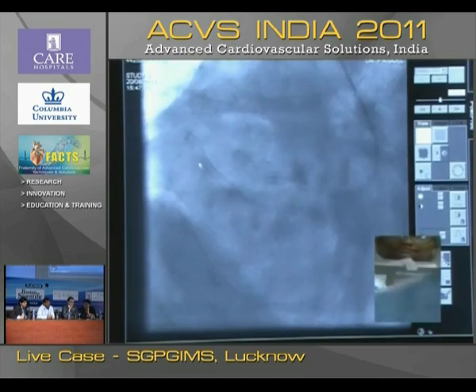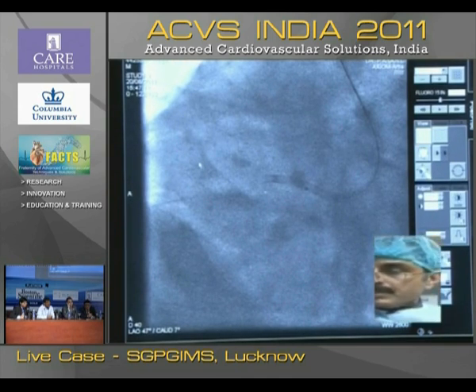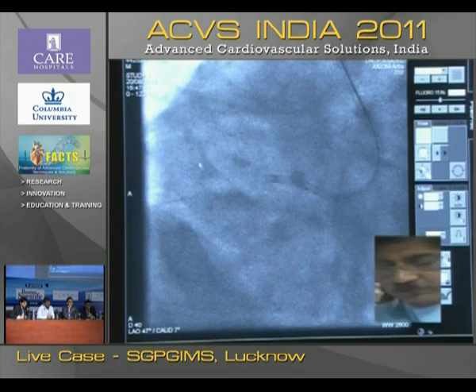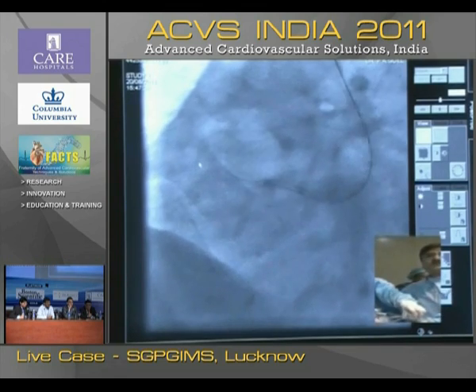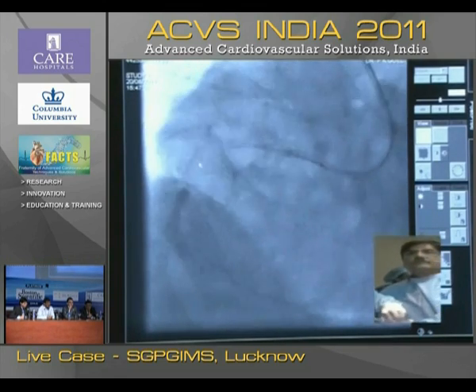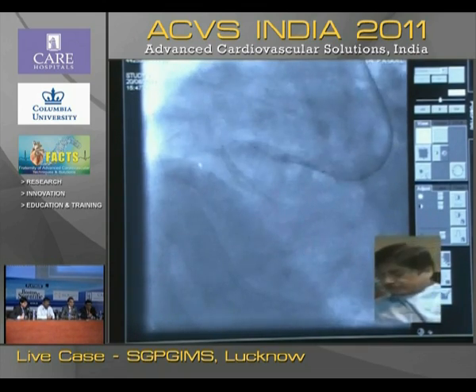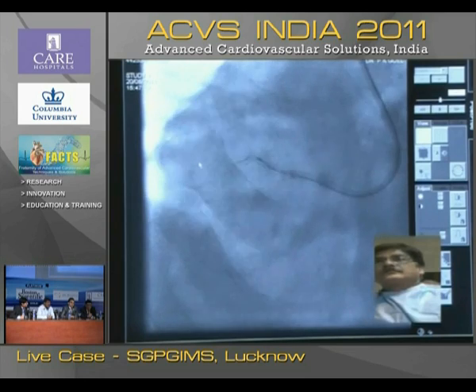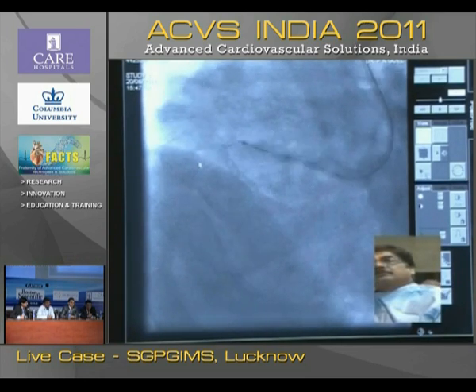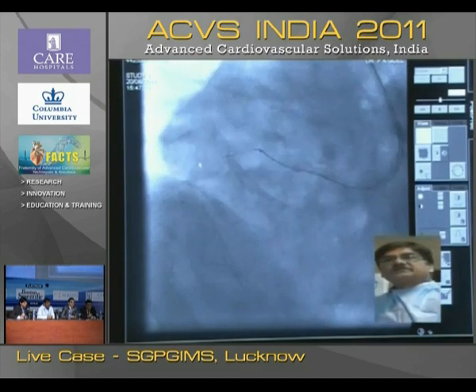Okay. Hold on. Wire introducer. Oh, sorry, doctor. Yes, please. Just hold on. Are they getting the image? What wire is this? Okay. Fielder XT with micro catheter support. This is a Fielder XT. Okay. Yes, please.